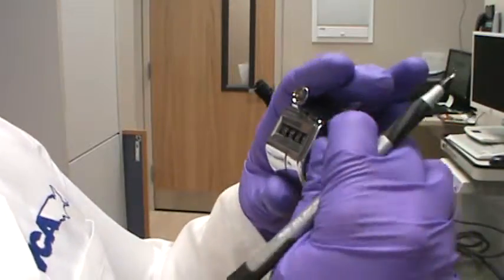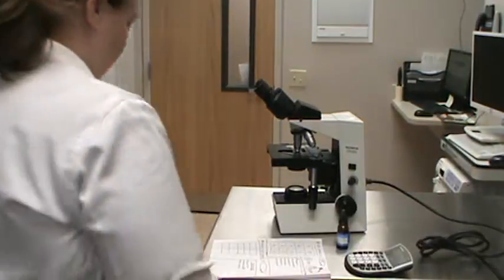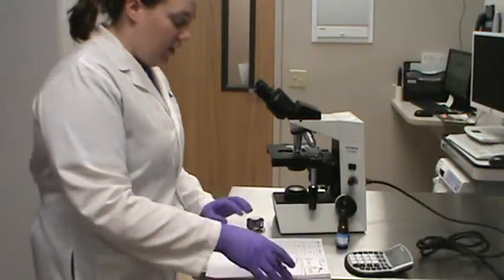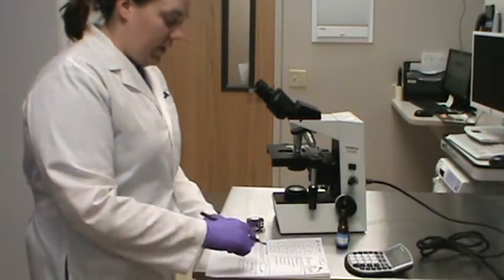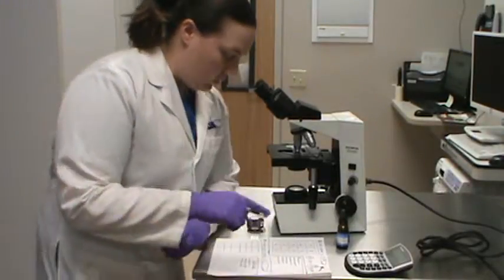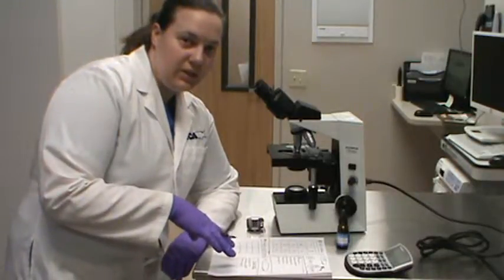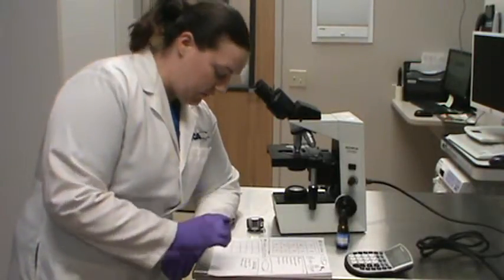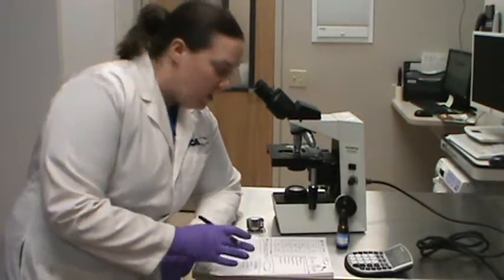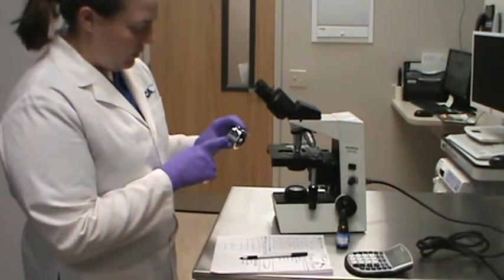So I'm just going to reset this to 0. Between this and tallying, I make sure I have 100 white blood cells counted. Then this box, I will tally up afterwards, and that'll be the percentage of white blood cells that I see on my slide. We'll also have a little section down here where we write any morphology changes that we see on our slide. And then we'll do our platelet count or our platelet estimate. Okay, so leave this over here for right now. And again, my counter is at 0.